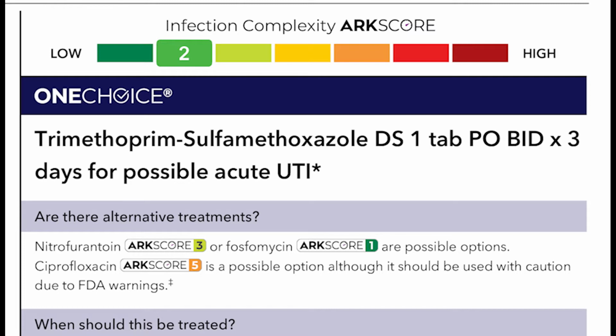We have an algorithm we put in place in order to determine whether an antibiotic would be better or worse regarding its effect to the patient. And this includes FDA warnings. It includes whether or not there can be an adverse effect to certain organ systems in a patient, whether or not there needs to be special drug monitoring, lab work that needs to be associated with the antibiotic.